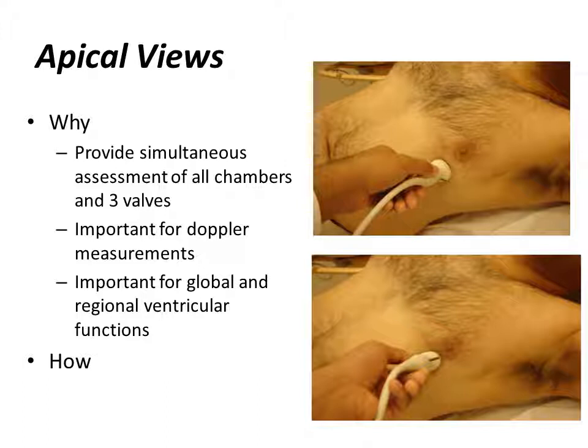Again, you can look at their size and function, so to speak, as to how well things are working there. You're able to see the mitral and the tricuspid valve and the aortic valve later. So we'll have a look at what all it helps us to ascertain.